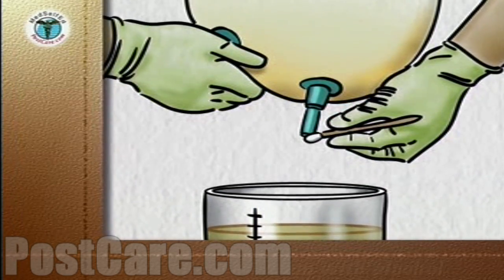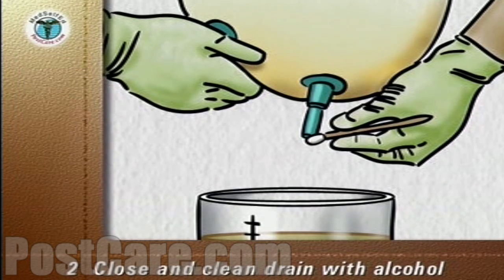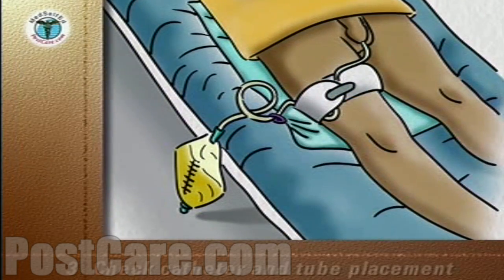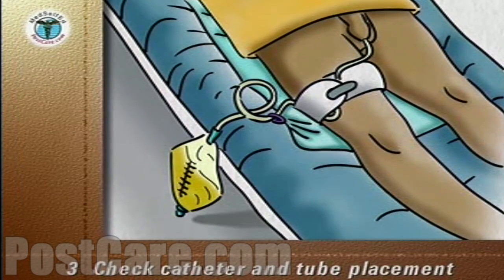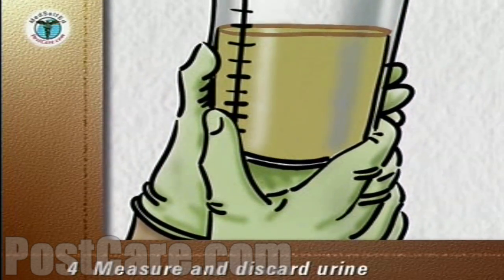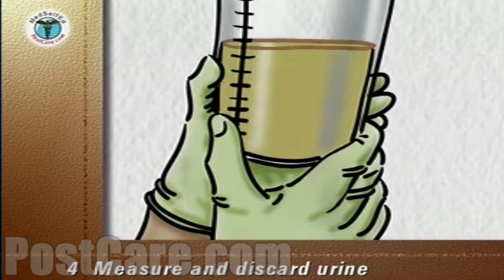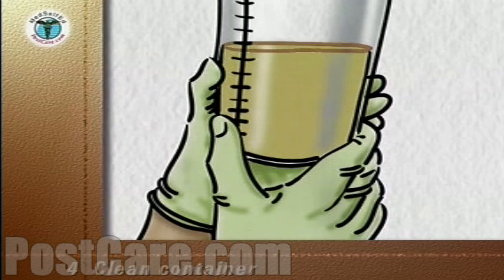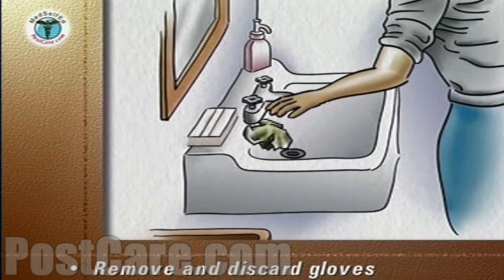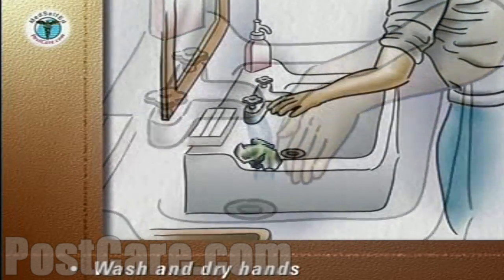When the drainage bag is empty, close the drain, wipe the end of the drain with an alcohol wipe, and replace the drain in its holder at the base of the drainage bag. Discard the alcohol wipe into the plastic storage bag. Check that the catheter and tubes are in place. Take the equipment tray and the container of urine into the bathroom. If your doctor or nurse has asked you to record the amount of urine, measure and make a note of it now. Discard the urine down the toilet and clean the container with liquid soap and water. Remove the gloves and discard them into the plastic storage bag, seal the bag and put it into the trash. Wash and dry your hands and discard the paper towel into the trash.